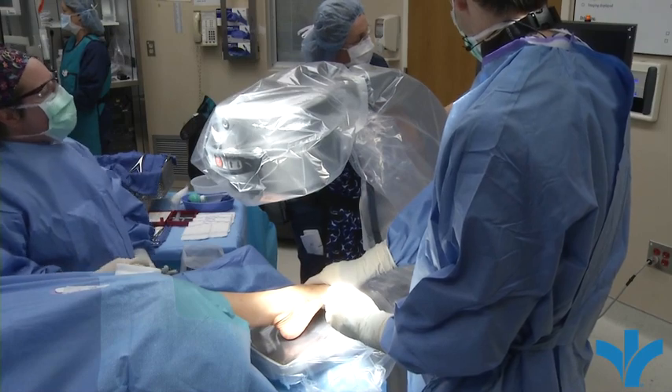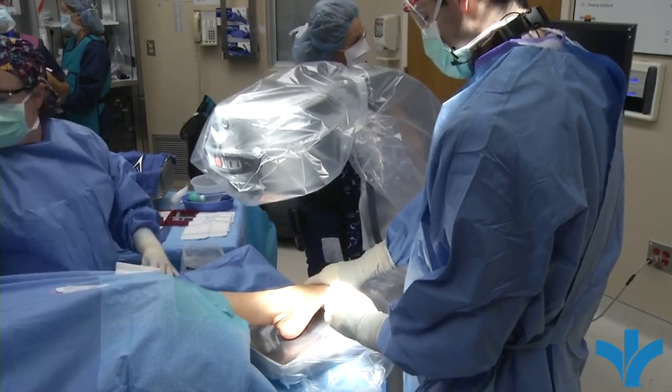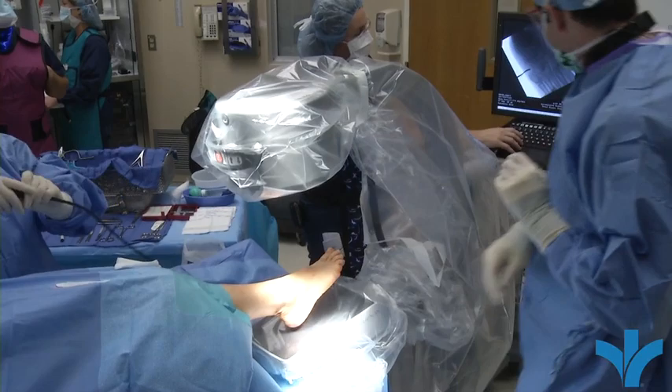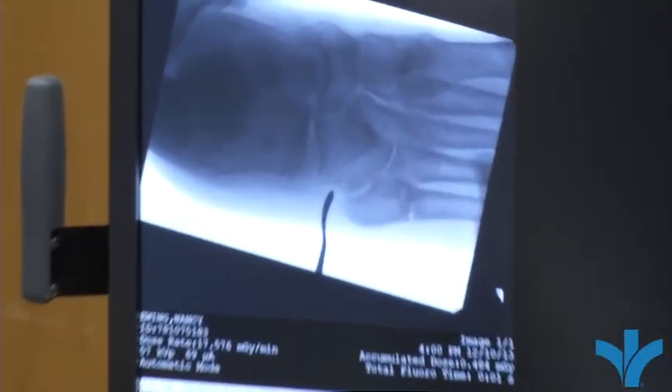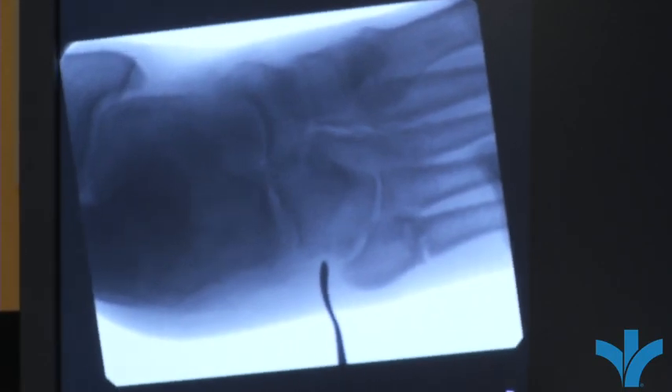We're just using a metal device here to help find our spot. You can see the crack in the bone on the x-ray. That crack has been there several months and hasn't shown any signs of healing, which is why we're here today to try to address that problem.